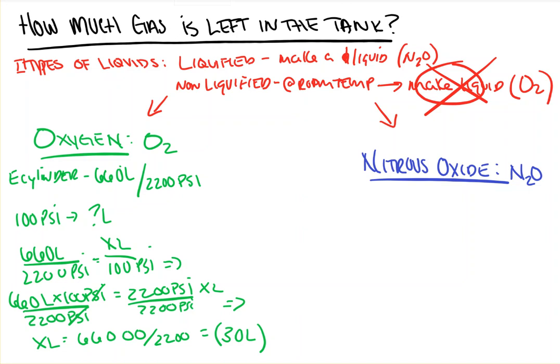Otherwise you could have a wrong decimal point, and it's an easy equation to throw away on a test. But worse, in real life, you might not just get the question wrong, but maybe you think you have more time than you actually do with an oxygen tank for transport, etc. So that's a super easy way to figure out how much oxygen is left in your tank.